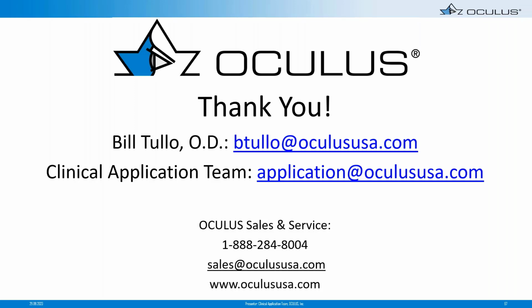On a similar note, you mentioned that the Pentacam is very accurate. However, sometimes not all of the measurements that we take are useful, even though the Pentacam is measuring accurately, such as a scan on a patient whose contacts have left an impression on their eye. How long do you need to have a patient that's been wearing contact lenses for a long time wash out? And does that depend upon the type of contact lens?